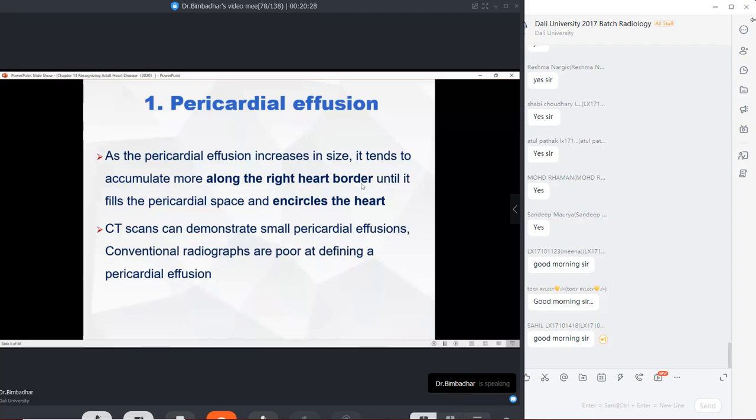But remember, conventional radiographs cannot assess the posterior side of the heart unless we take a lateral film. And in the same way, the changes in the densities and differentiating the fluid density from the density of the real cardiac shadow, meaning the myocardial muscular shadow, cannot be done on a conventional radiograph. AP view or PA view, a traditional radiograph cannot analyze this.